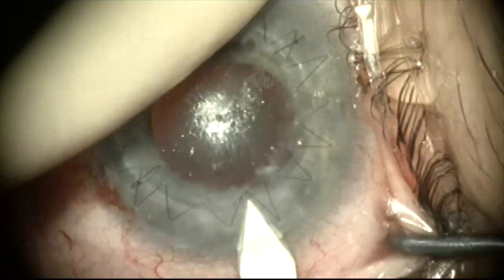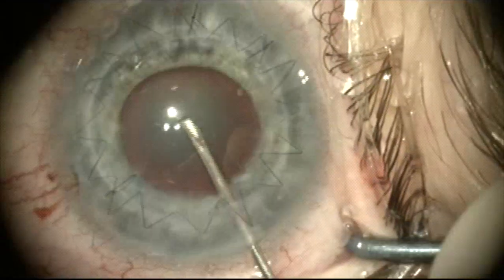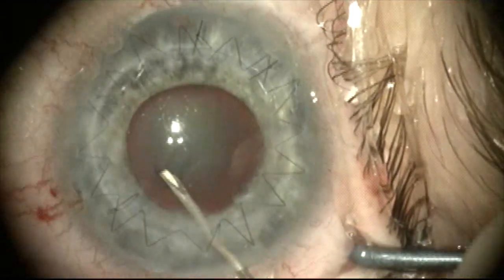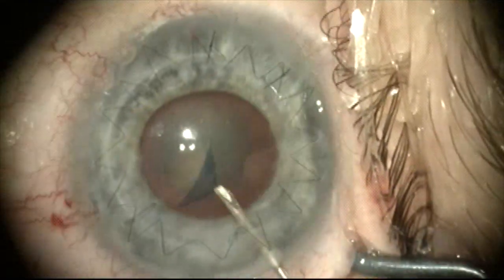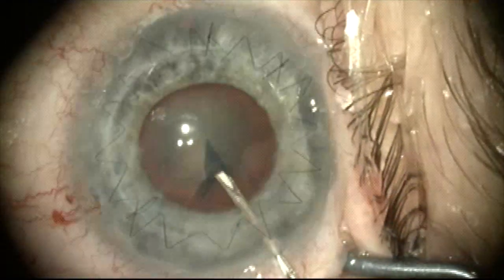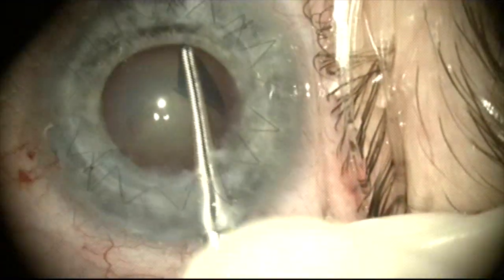Here we're making the clear cornea incision and I want to avoid breaking the running suture. Usually I will remove the running suture before doing cataract surgery, but in this monocular patient with one diopter of astigmatism after the graft, I felt it was best to leave the running suture in place.